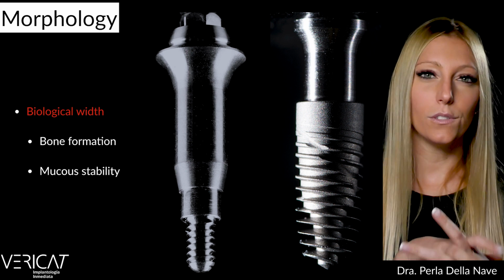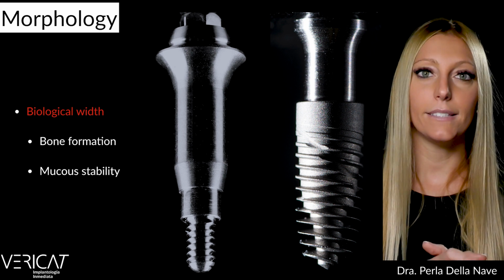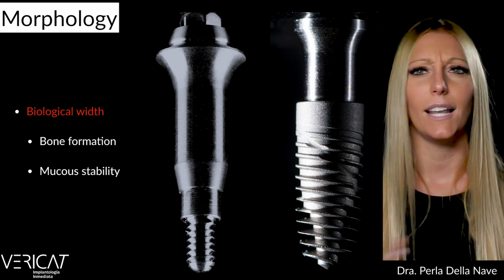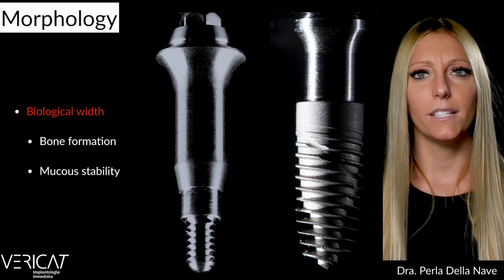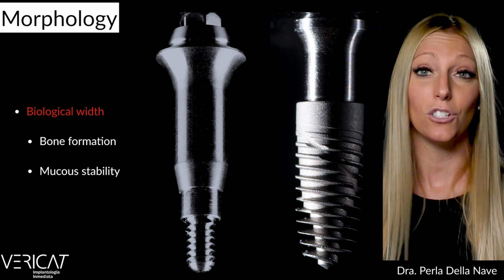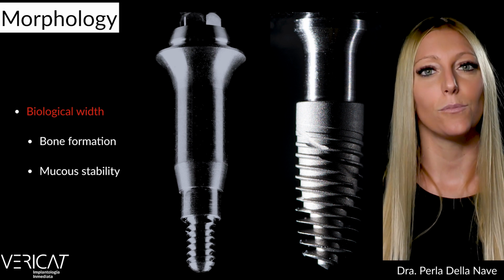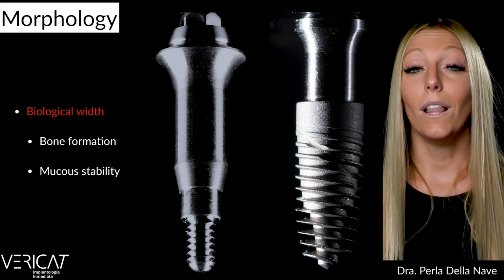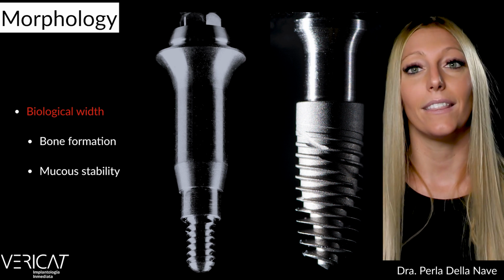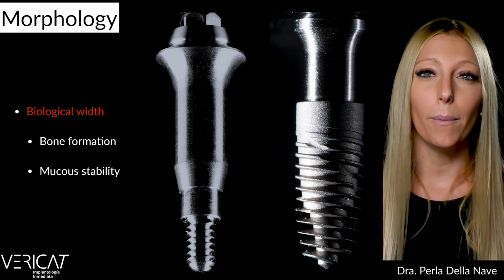And one more concept. One could think: thin biotype, surgery, flap raising, I know a certain retraction will take place during the healing phase, so I better select a lower abutment, which on the day of the surgery ends up in a 2-3 millimeters subgingival position, in order to avoid, after the healing period, an excessively exposed abutment connection. Well, on the contrary, we think it's always necessary to choose the higher abutment that the soft tissue can admit on the day of the implant placement, and even more in thin biotypes.